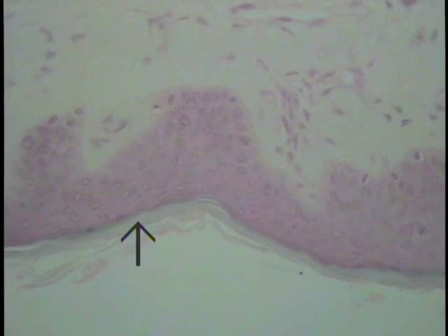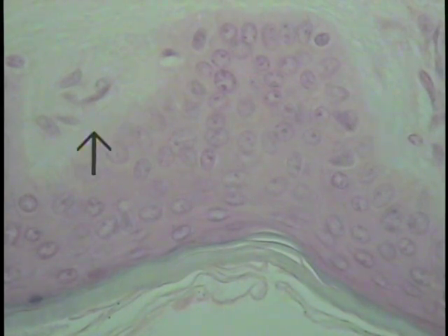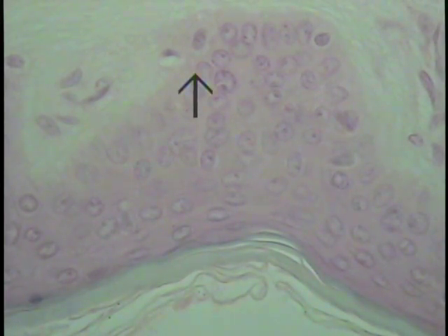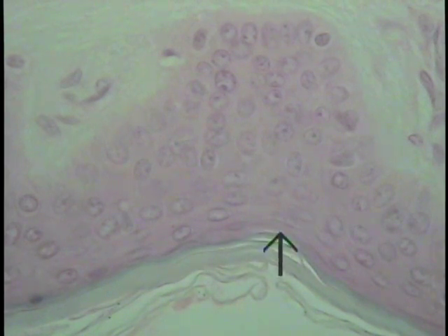Examine a section of skin at increased magnification. A typical section at increased magnification through thin skin. Once again, a very thick type of epithelium consists of several layers of cells, therefore satisfying the definition of being stratified. These cells change their shape, which one need not worry about at the present time, and become a very flattened squame-like cell. You can see here by the nuclear profile and a little bit of cytoplasm that is extending out, and then will become the keratin.